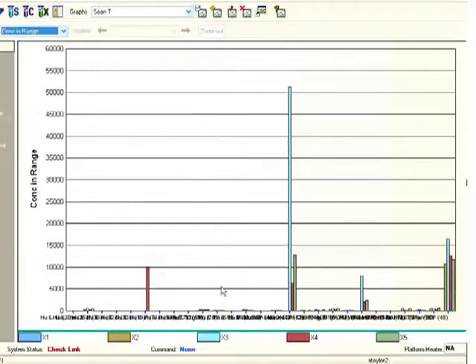So I have values for these that I can look at. This was obviously very high. Okay, so I have this data now for all of these analytes, and what I can do now is also export this data to Excel. So I've basically made a smaller parsing out of my data, and I can say, okay, let's export this graph data to Excel.